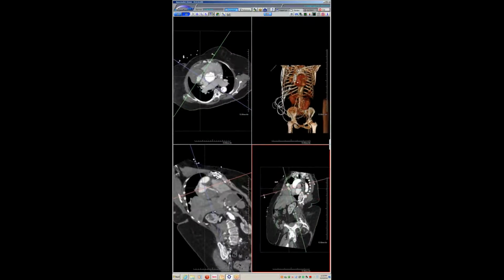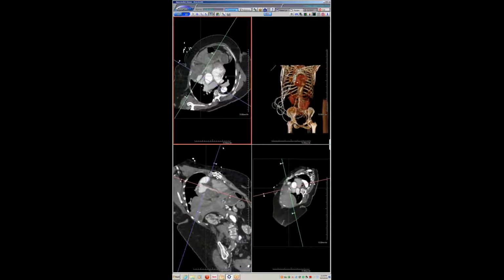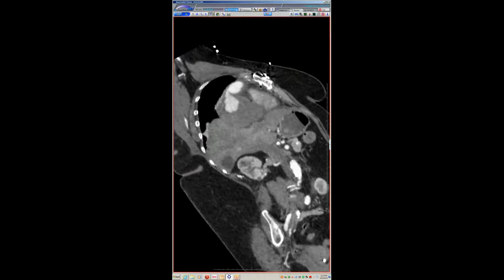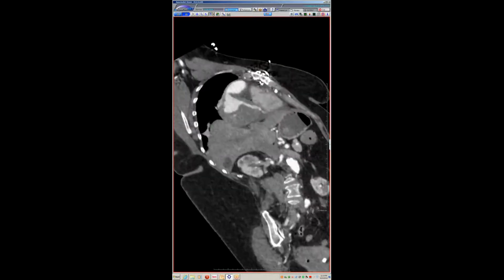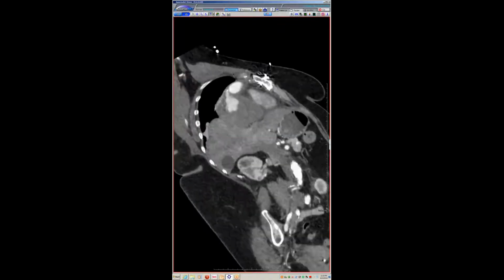Patients are often asymptomatic. Sometimes they do present with cardiovascular symptoms, but if they're untreated, there is a high mortality, although there's probably a lot of people out there walking around with these who just don't know about it. But this was an incidental finding. The patient just had a cough and had the finding on this chest x-ray that led to everything else. So that's a nice bypass graft aneurysm. Yeah, the ACR case in point on Monday was a bypass graft aneurysm.